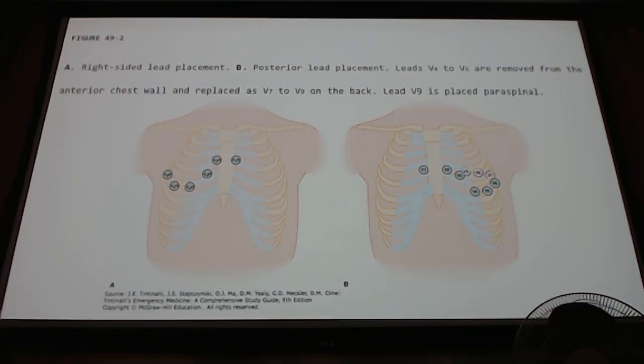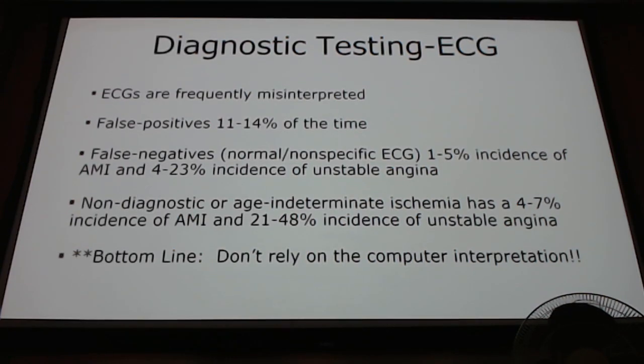So here's our right-sided lead placement, and then we have our posterior lead placement on the back on the right image there.